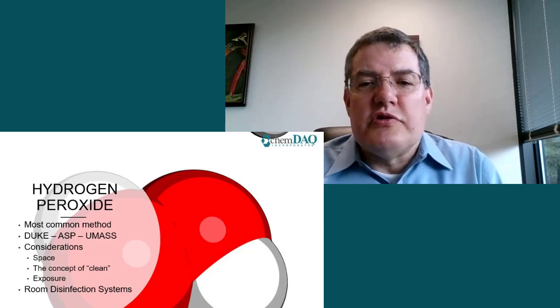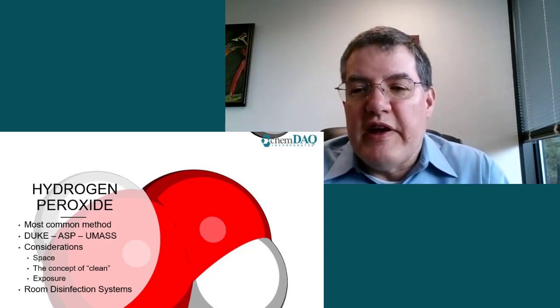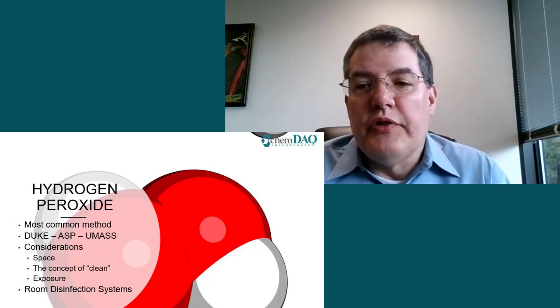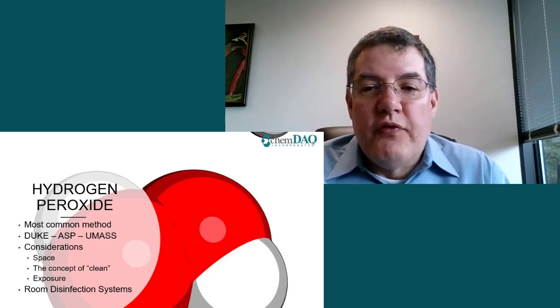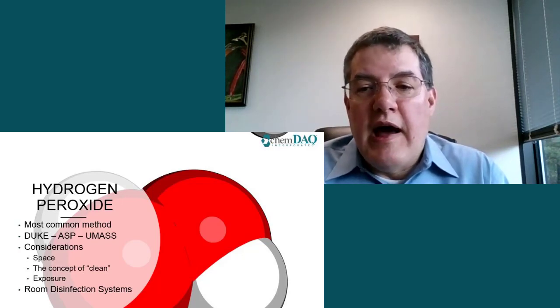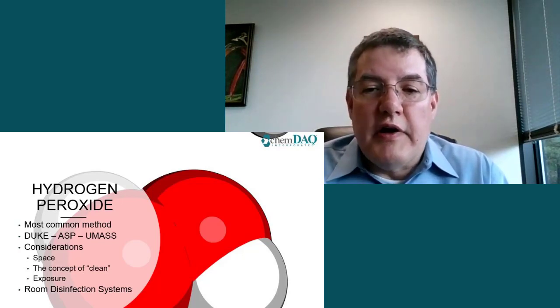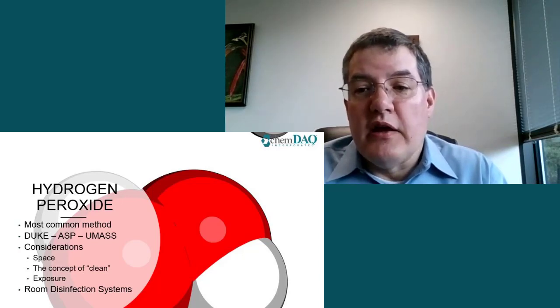The second approach is room disinfection. Preliminary results indicate that hydrogen peroxide vapor is an effective virucidal agent when used to disinfect N95 masks using a room disinfection unit. The Duke School of Medicine recently announced that they are disinfecting N95 masks with hydrogen peroxide vapors before redistributing them to healthcare workers, and this process is being extended to other hospitals in their system. Battelle, out of Ohio, also just received emergency clearance from the FDA for its critical care decontamination system, which can decontaminate up to 80,000 masks per day using hydrogen peroxide.